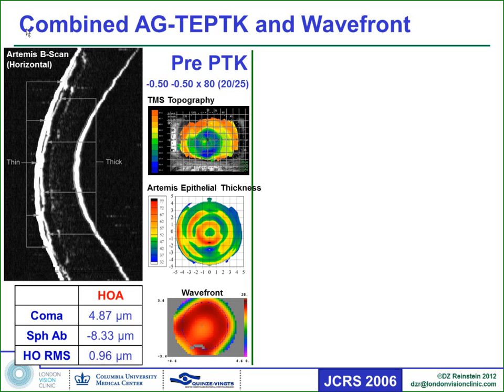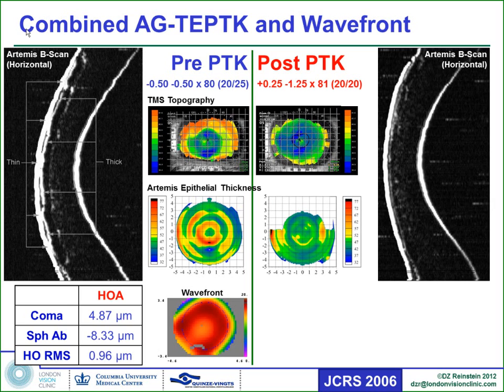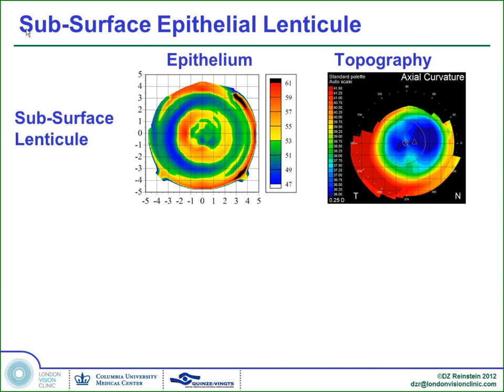His epithelial profile looked like this. It looked like thin, thick rings. And that meant that he had a multifocal, like an array lens of epithelium. And we all know how good array lenses are. And so what we did was a transepithelial PTK, wiped out those irregularities, his epithelial profile went completely regular, and his contrast went up to high normal. So what we're doing here is producing a Z4,0 carve-out into the stroma, which gets filled by epithelium, so that the topography doesn't see it.